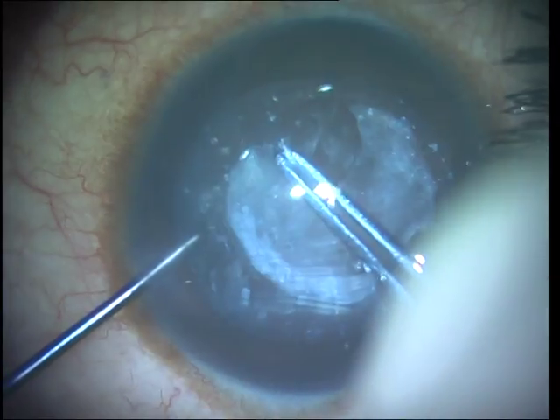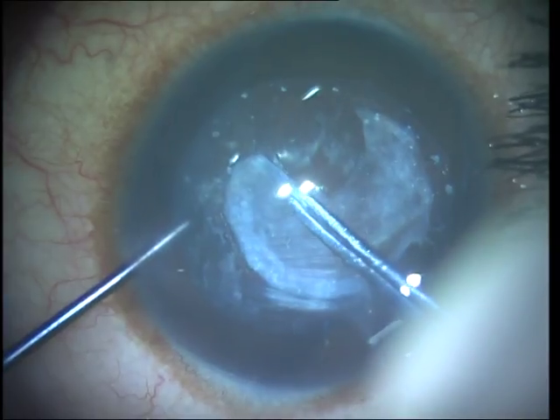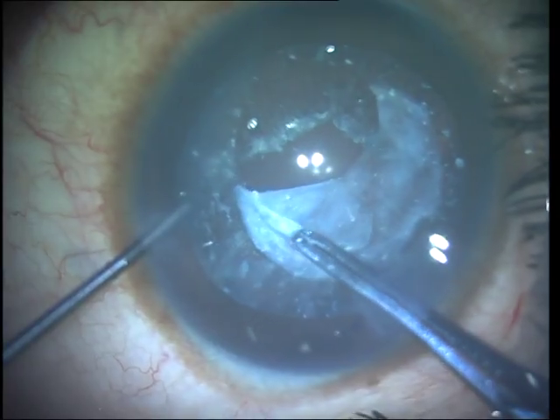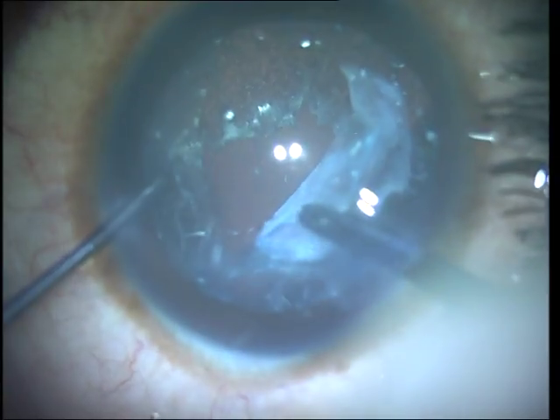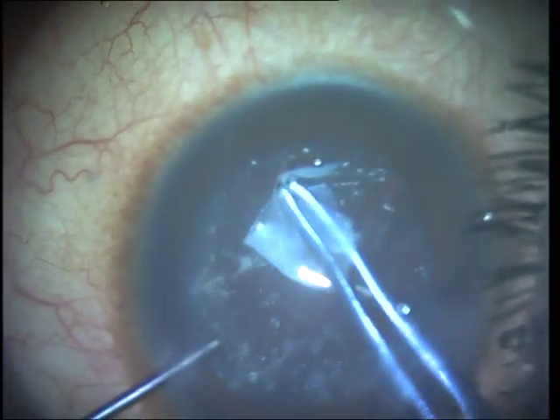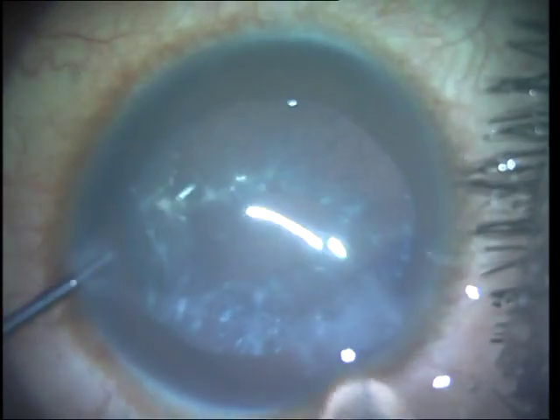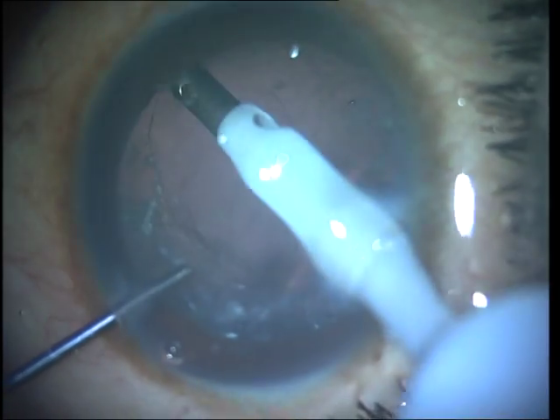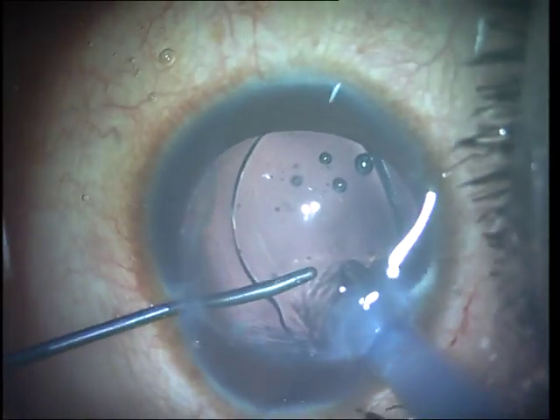I go ahead now and complete my rhexis. The capsule is again elastic, so I have to be careful that it doesn't run out into the periphery. You can also visualize the plaque separating out and the capsular rhexis margin tearing separately beneath the plaque. The tear is almost completely finished and that last tag is then joined with the starting point. There is very minimal cortex remaining in the periphery and this can be gently removed using just capsule polishing mode if required, and the lens is finally implanted into the bag.